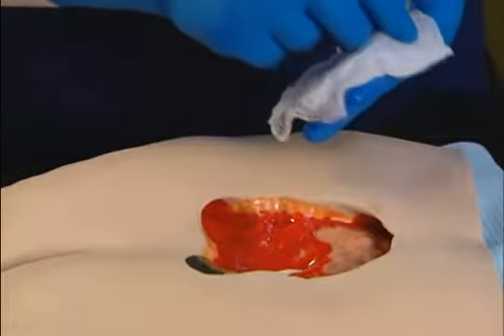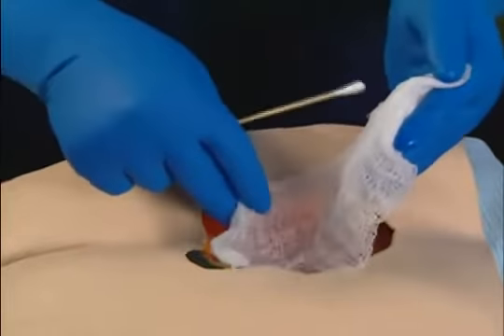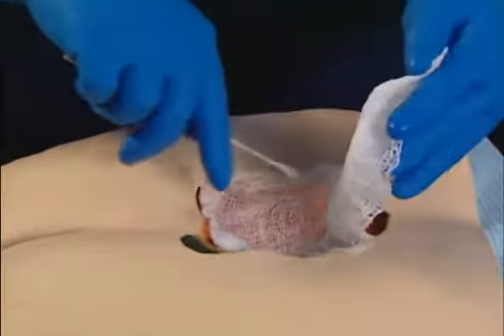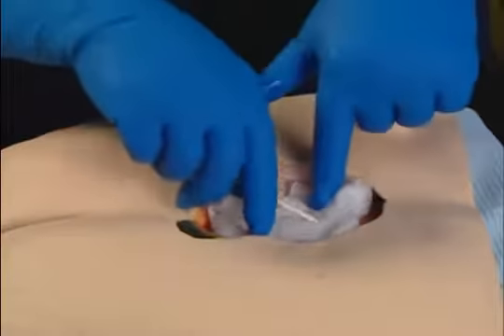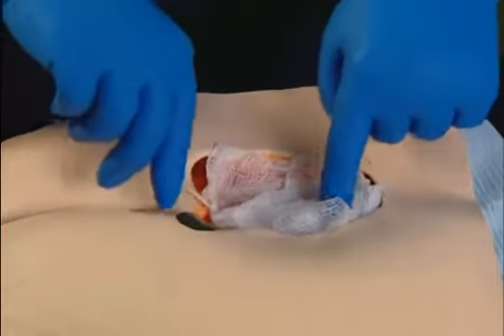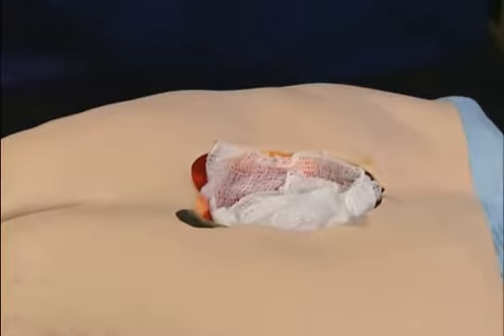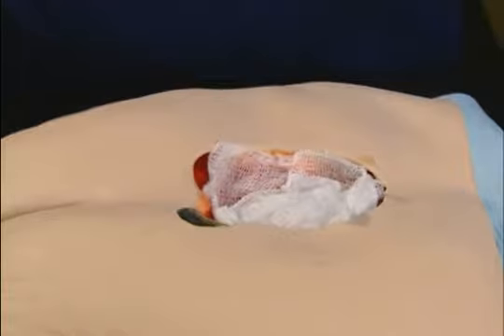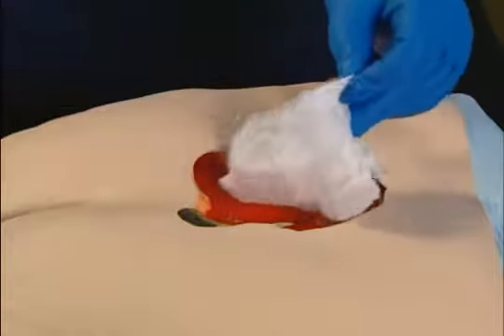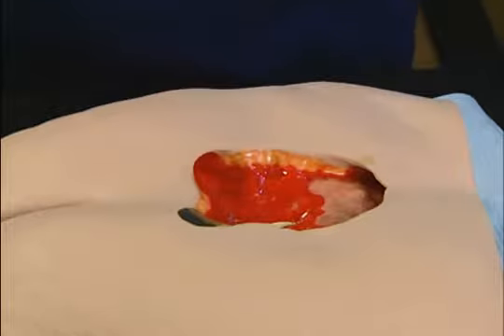Moist gauze dressings are used to help maintain a moist wound healing environment. When moist gauzes are applied to the wound and allowed to dry out, they become known as wet-to-dry dressings. Wet-to-dry dressings are sometimes used for mechanical debridement. A moist gauze adheres to the necrotic tissue as it dries out, allowing the necrotic tissue to be removed when the dressing is removed. However, this method of debridement is not universally liked for a number of reasons.